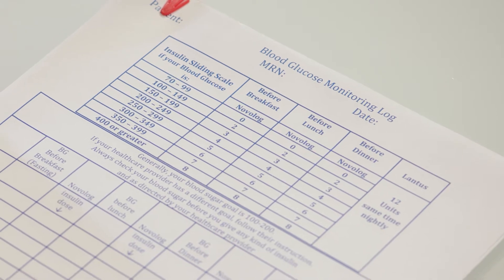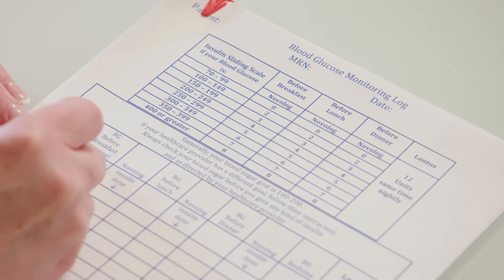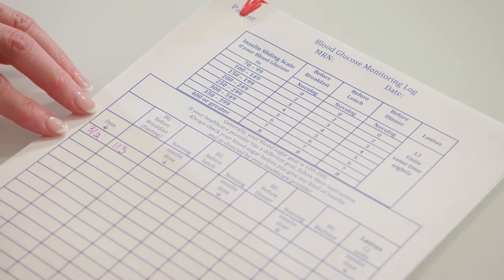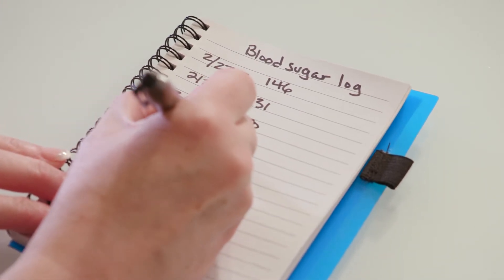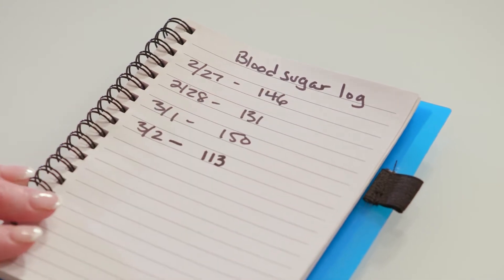Follow your healthcare provider's instructions for recording your blood sugar levels and medication doses. They might give you a blood sugar log or you can use a notebook. They'll use this information to see how your treatment plan is working and decide if it needs to be changed.